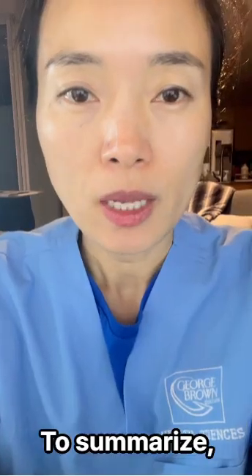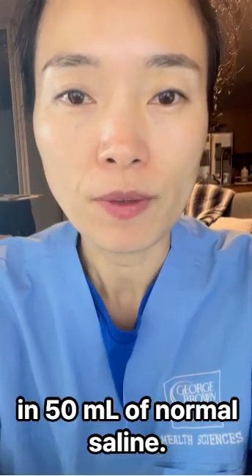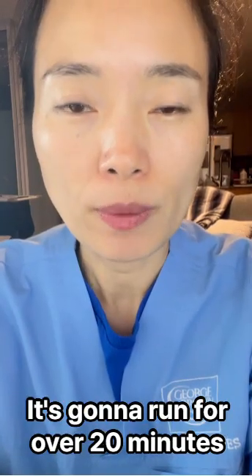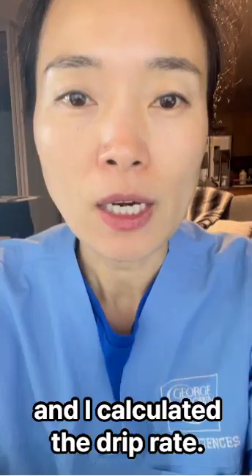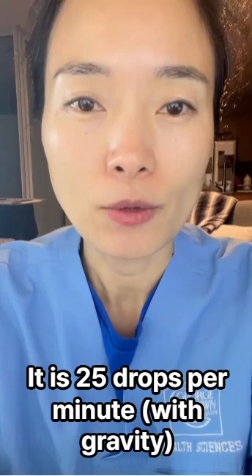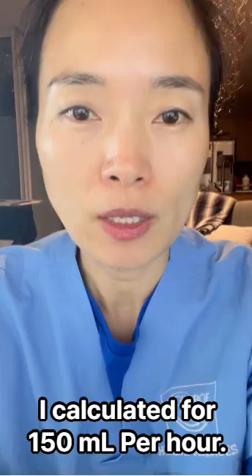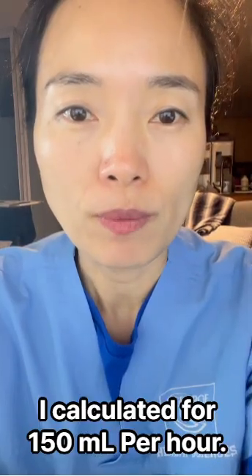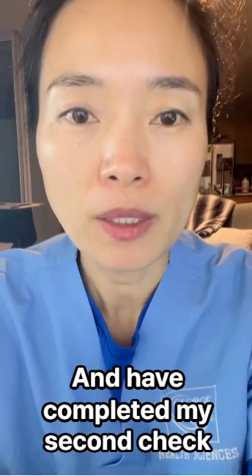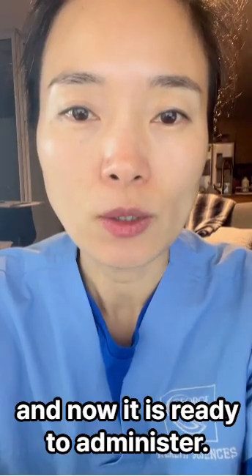To summarize, I have prepared pantoprazole 30 milligrams in 50 milliliters of normal saline. It's gonna run over 20 minutes, and I calculated the drip rate. It is 25 drops per minute, and for the pump, I calculated 150 milliliter per hour, and I have completed my second check of the medication, and now it is ready to administer.